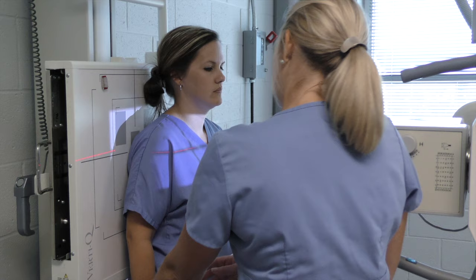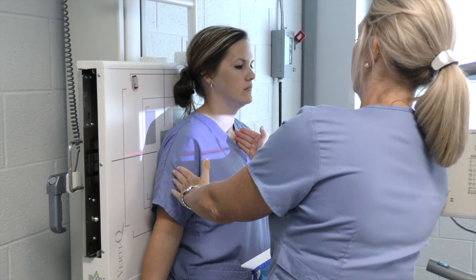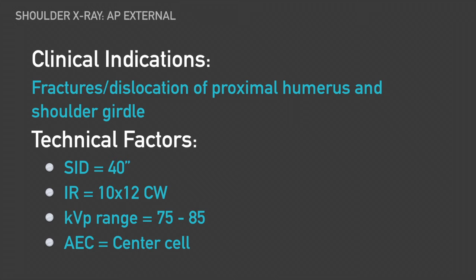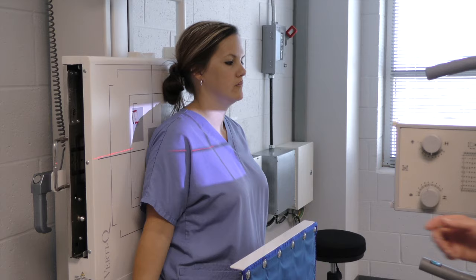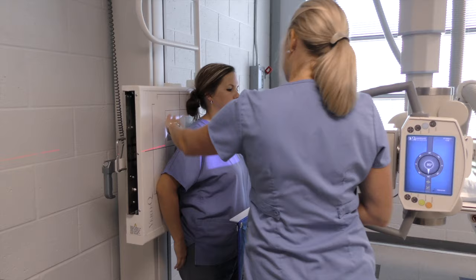The patient is standing against the board. If you'll turn your palm out, we'll start with the external view. We're going to open up our collimation — we always want to open it up past our sternum.